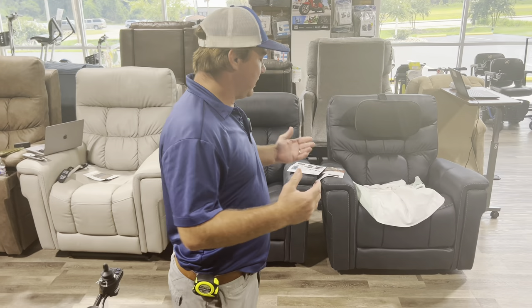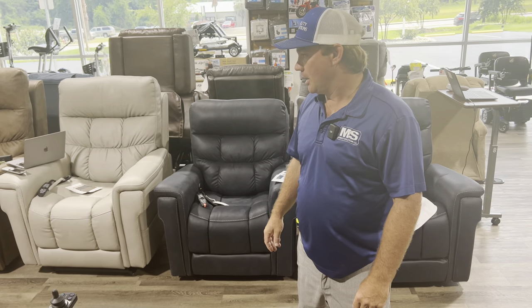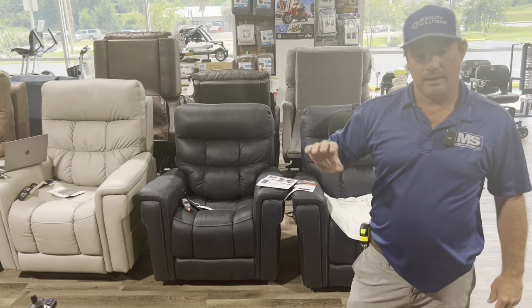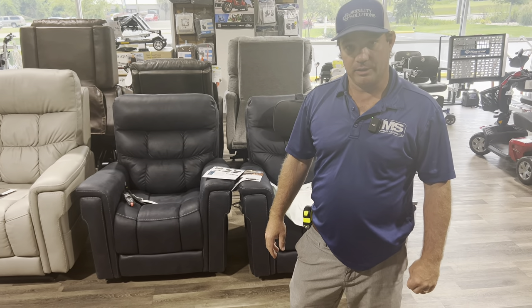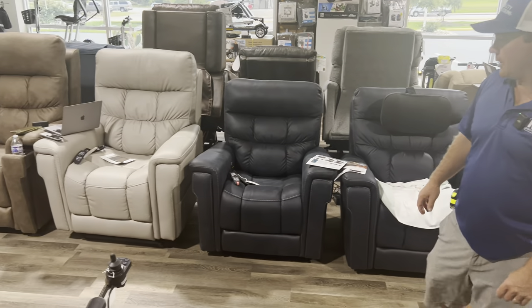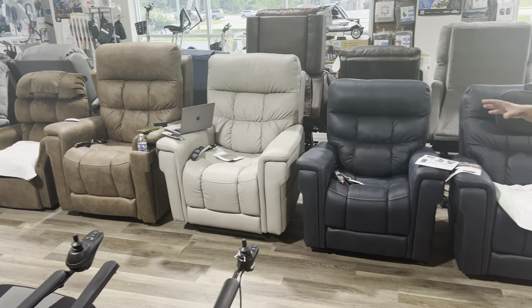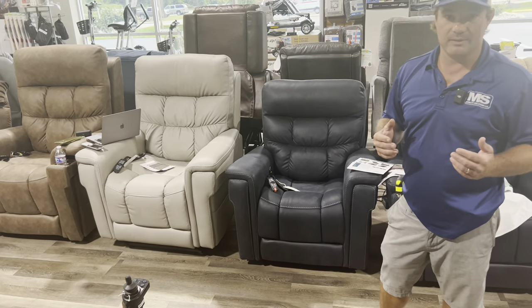Do we have any lift chairs? Yeah, we have some. Lift chairs are going to come in one motor up to five — they're even getting more motors in them. We stock and carry Golden Technology lift chairs and Pride Mobility lift chairs. Mostly the Viva chairs with Pride, which they've done a big change with the Viva line. They're starting to see new Viva chairs with a new mechanism — the old Vivas I didn't care for.